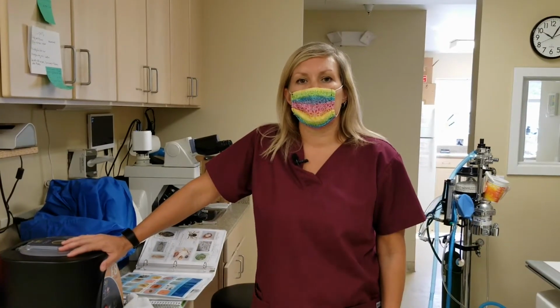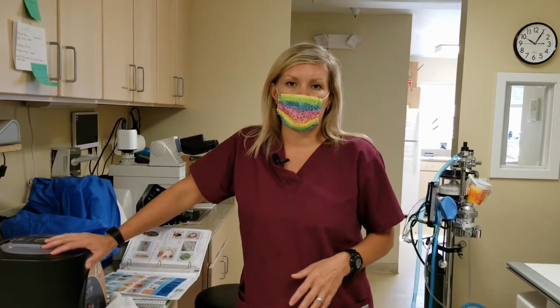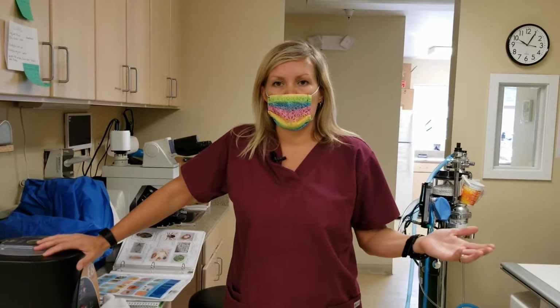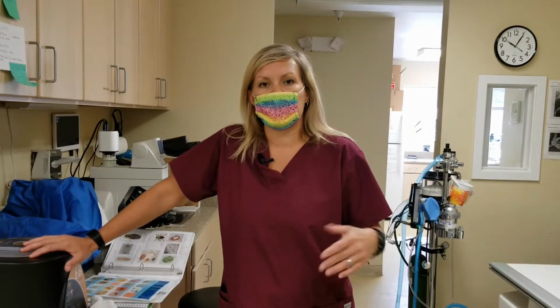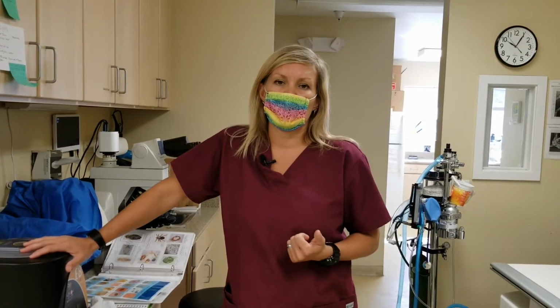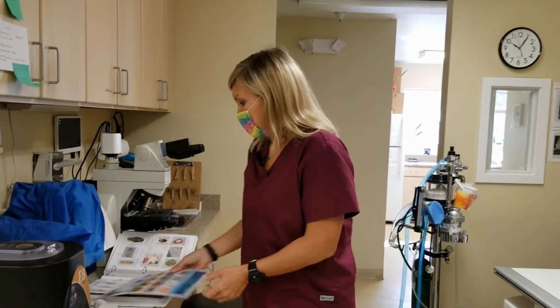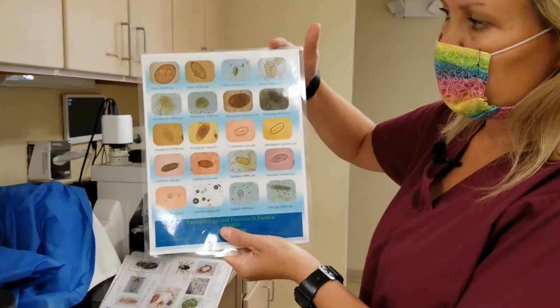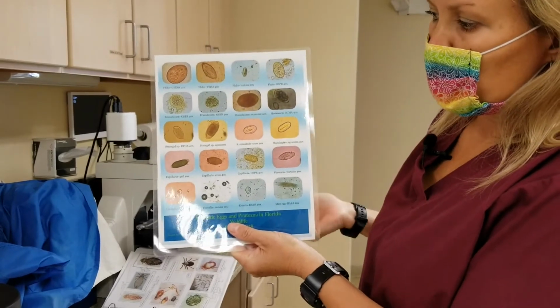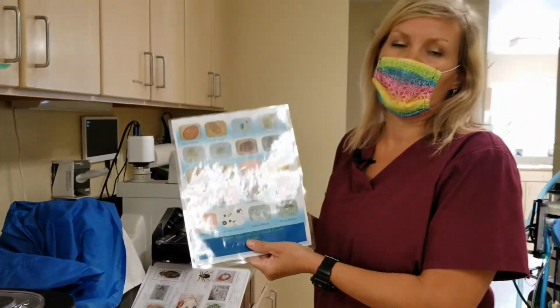Here at Crow, when the animals come in, we like to get a fecal on them and see what their parasite load is. If it's a tiny amount of parasites, it's pretty normal in a wild animal to have a small amount of parasites, but when they're debilitated, the parasites can go crazy inside of their body. So we do a fecal, and here's a little cheat sheet we have with different parasites. Each bird can have different types of parasites, and there are ones that are more common between each species.